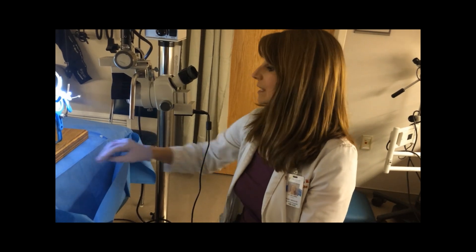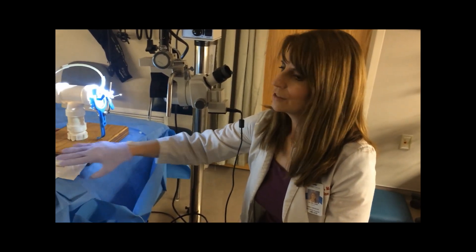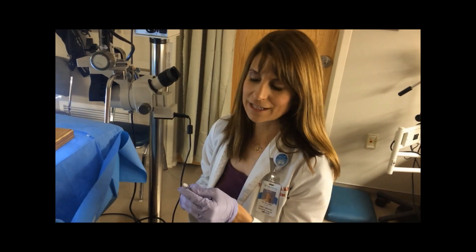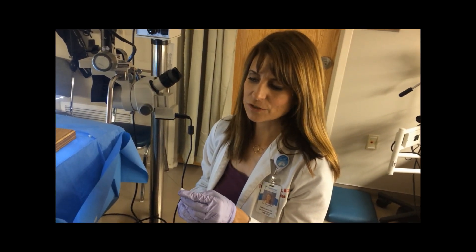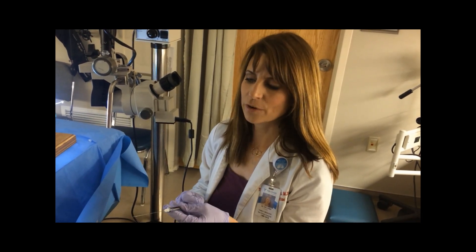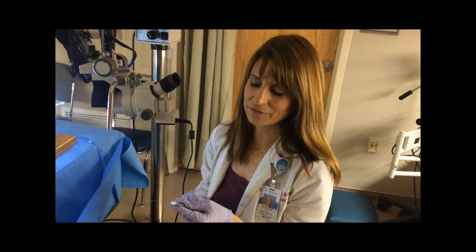The next thing that I do is actually numb up the cervix using a Podocchi needle. This is the Podocchi needle — it is the same needle that's used for dental procedures. You can see that there is a guide here so you do not go too deep. It is important that you also aspirate to make sure that you're not in a blood vessel.